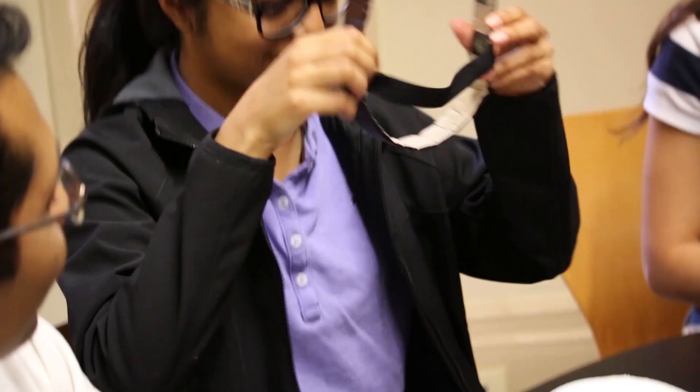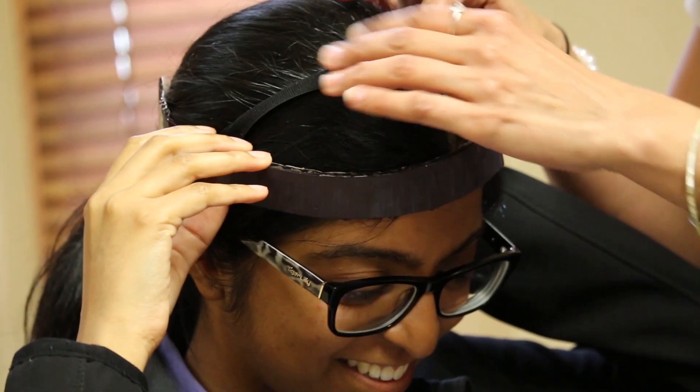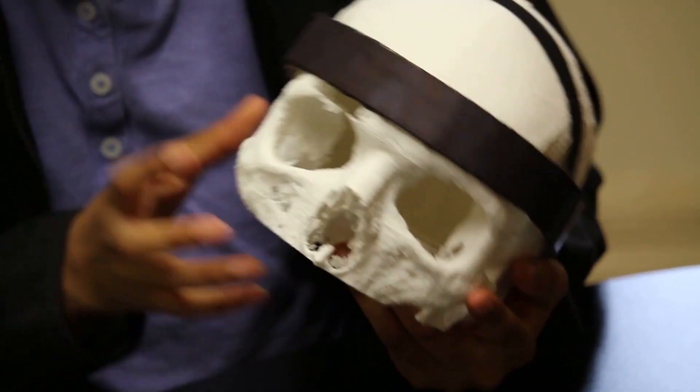This is our conceptual design of how our final product might look. It would be a wearable band across someone's head, and this band would consist of the sensors that we're talking about.